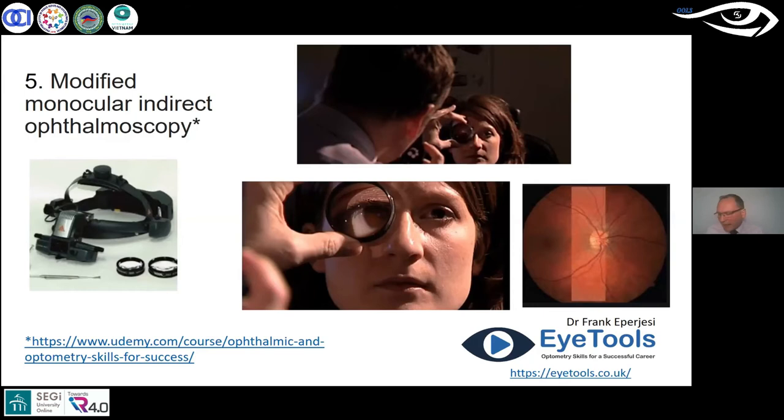The condensing lens is held two to five centimeters in front of the eye. I'm shining my ophthalmoscope through the lens and through the dilated pupil. I might need to adjust my ophthalmoscope focus to get a sharp image. This works really well. The downside is that, like any indirect technique, the image is upside down and back to front.